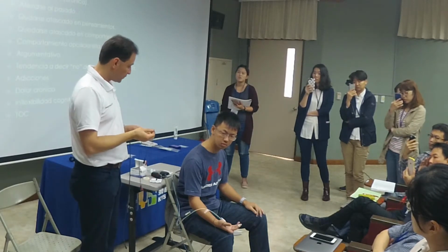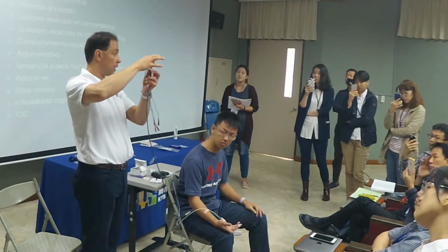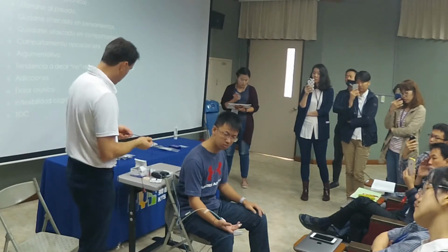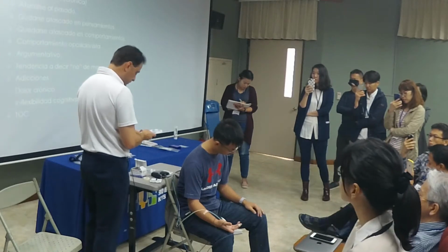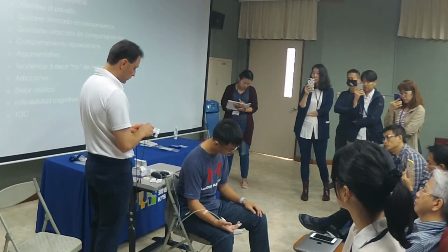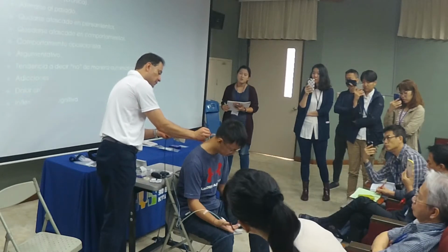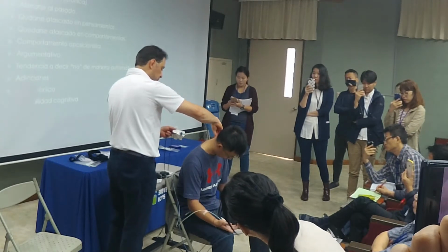Okay, so for the traps we're going to use for the neck, we're going to use channel 1. For the shoulders, we're going to use channel 2. And the way we do it is the same thing. We're going to clip it and button it before we use it. So which one goes on the left? The active, which is what color? Red. So I use a little bit of a diagonal placement.